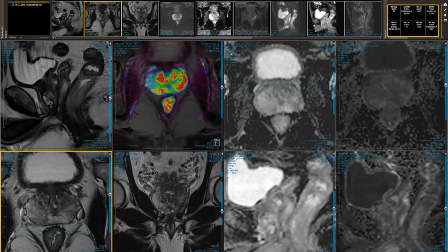It is very useful pre-operatively when I do a radical prostatectomy and I'm making decisions on nerve sparing when they're under anesthetic. I think it's a bit more useful then. Otherwise, an MRI will give you information on the contralateral side, the anterior part of the gland, areas that your digital rectal examination may not.